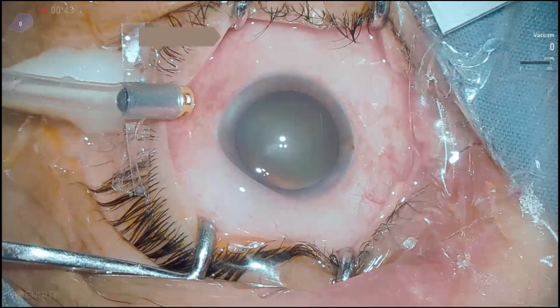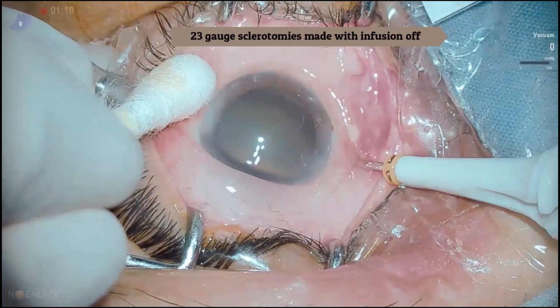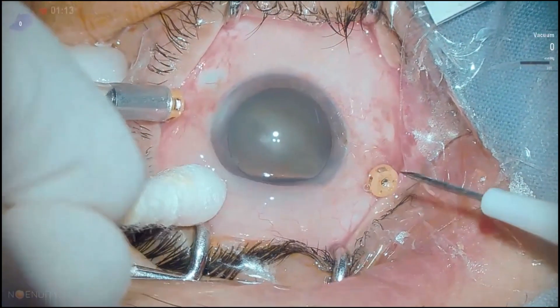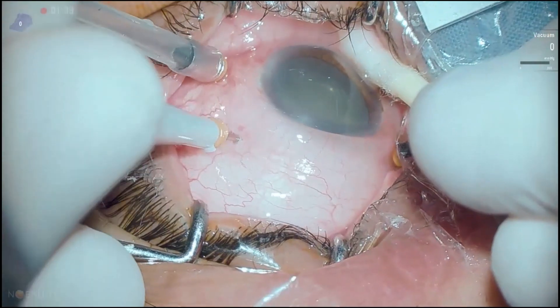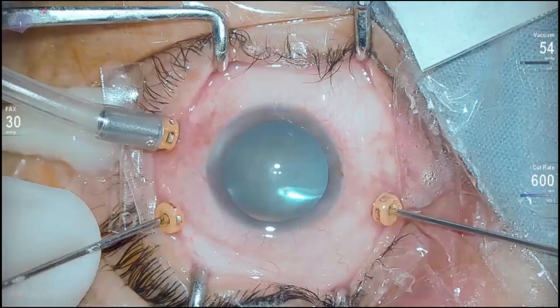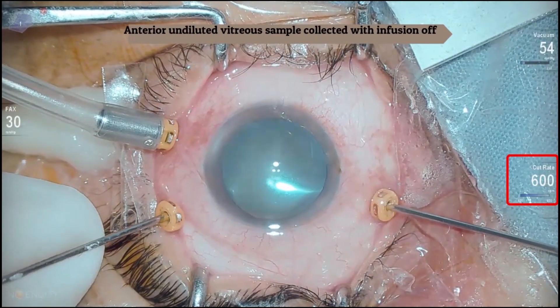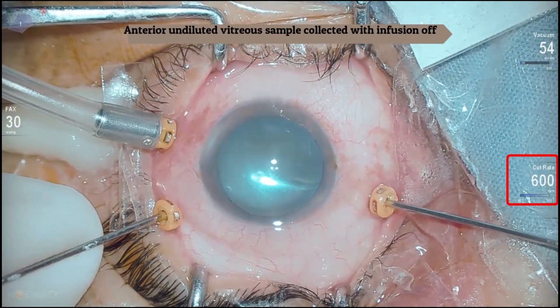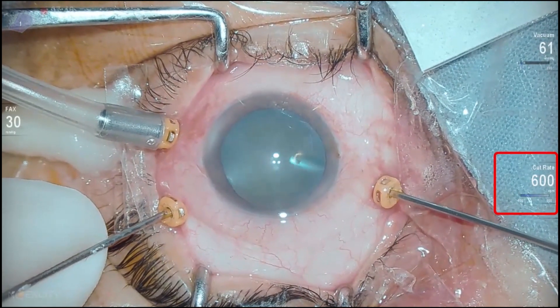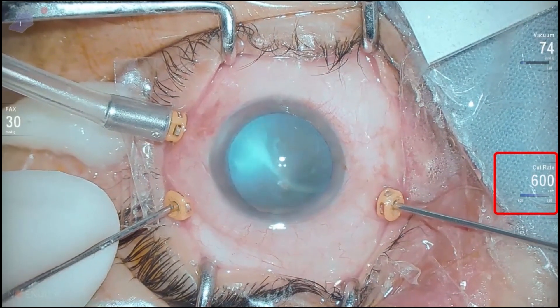23-gauge sclerotomies were made keeping infusion off. Undiluted anterior vitreous sample collection was done with a cut rate of 600 and manual aspiration by the assistant. This prevents mutilation of lymphoma cells, thereby giving high yield.